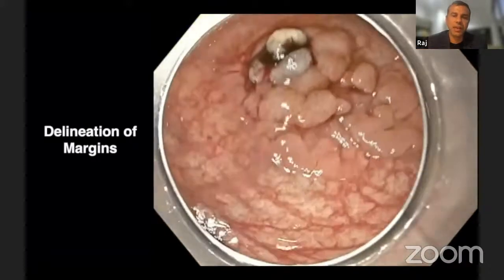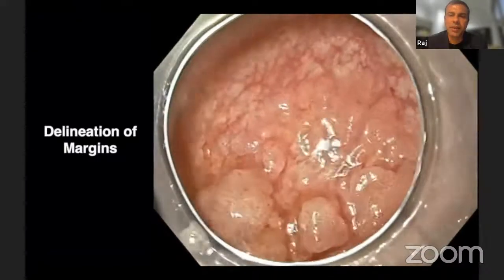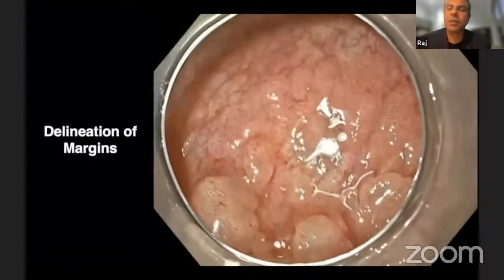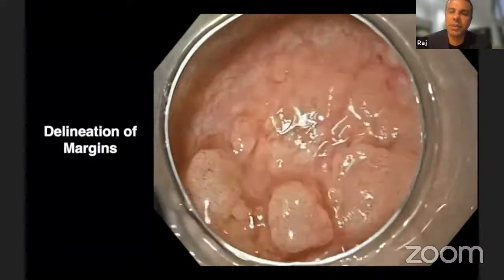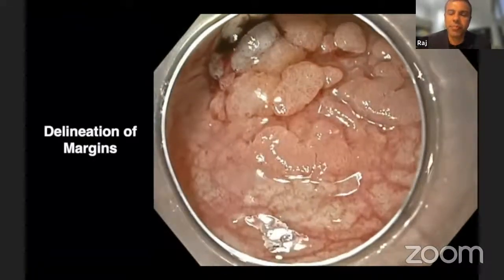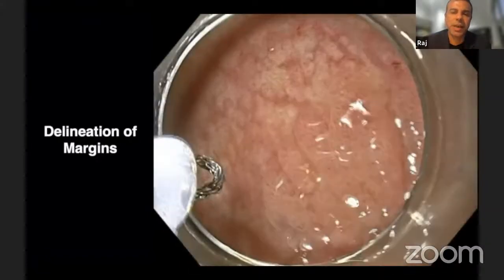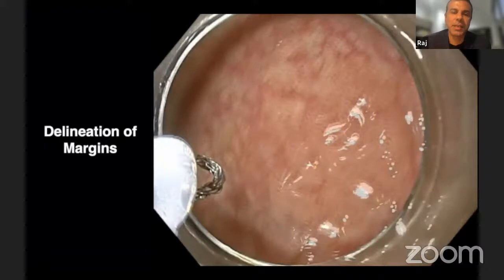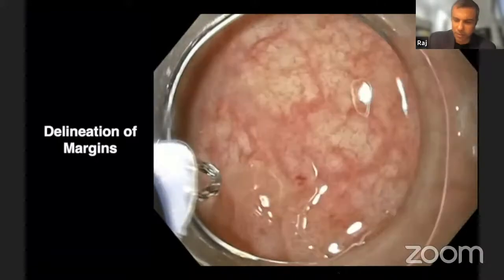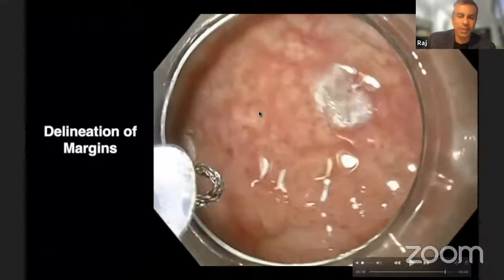But with TXI, you can actually see that there's a lateral extension, those flat areas there, very nicely seen with TXI. So I think this is also important, especially when we want to remove lesions and prevent residual polyp being left behind. It's important to be able to understand where the polyp starts and where it ends. So this was used to mark the lesion before removal. So these are some of the things which can help with this TXI mode.